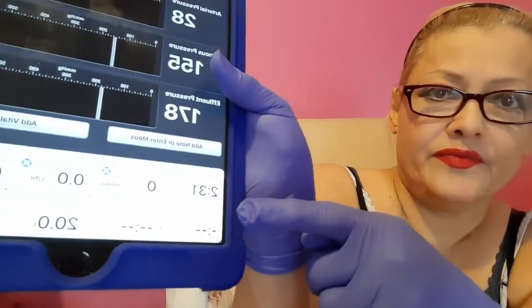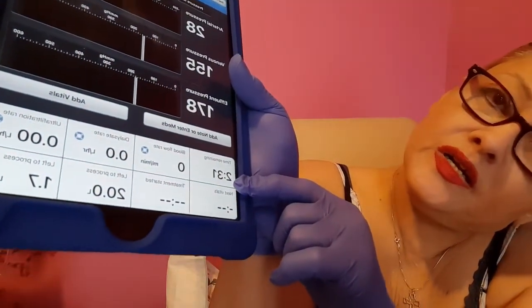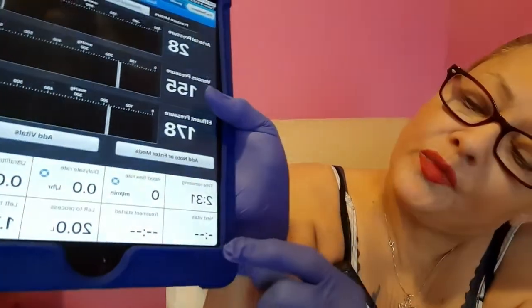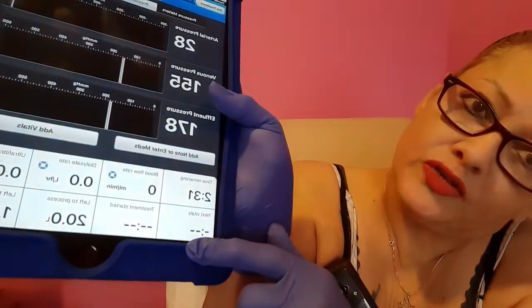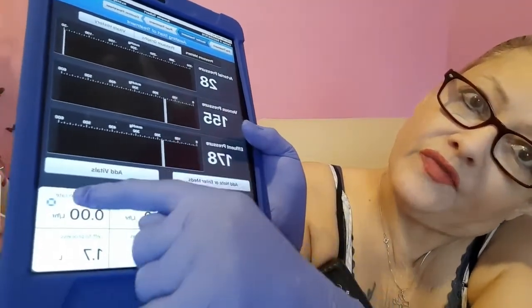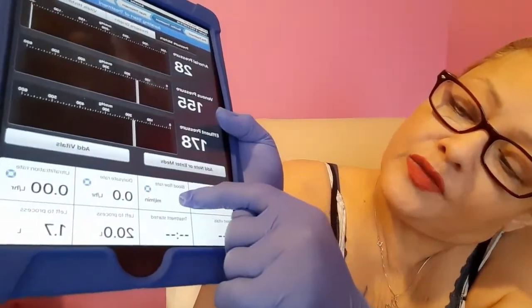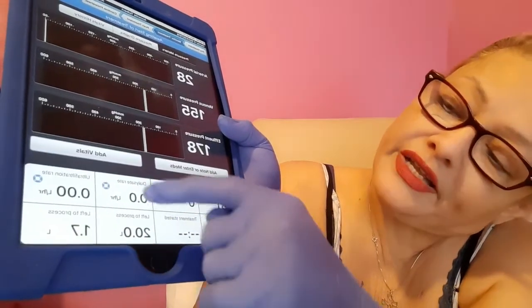Also, on the bottom, it has the amount of time of dialyzing, which is 2 hours and 31 minutes. This will be a half hour interval, and it'll tell me when I need to take a blood pressure, and I have to chart it in there. See, it says add vitals, and that's every 30 minutes. Then it has the blood flow rate, the treatment. When the treatment started, it'll clock in.